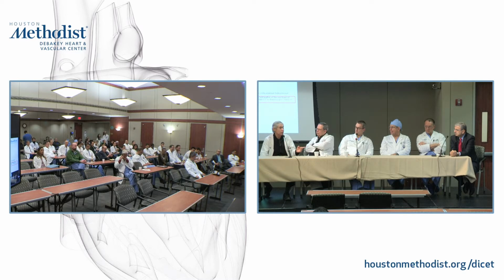The other thing I want to mention is that if the patient were to go for surgery, and if the patient did have coronary disease, which this patient doesn't have, or bypass grafts in the past, a class 1 indication for CT is to do preoperative planning to look for the location of bypass grafts so that when you go into the chest, you don't have a potential for destroying a graft in the interim. And the last thing I want to say is that CT is not first line for looking at valves, okay?